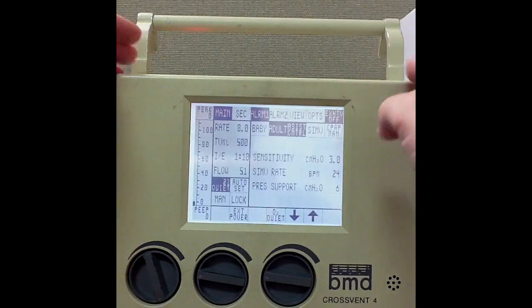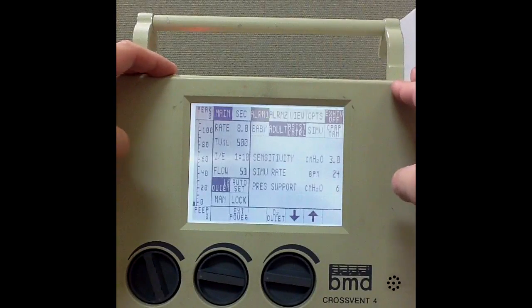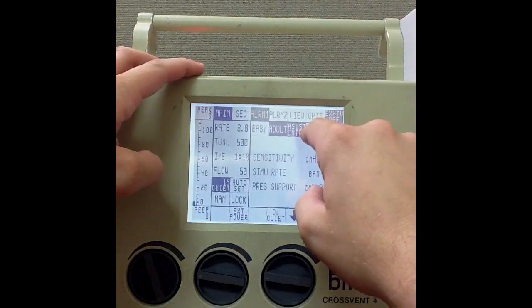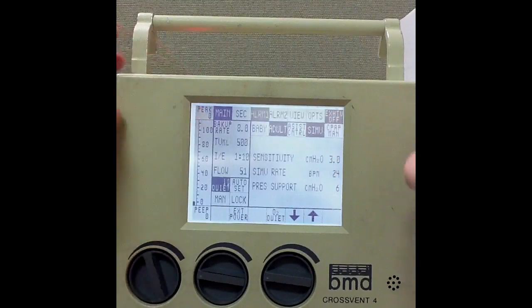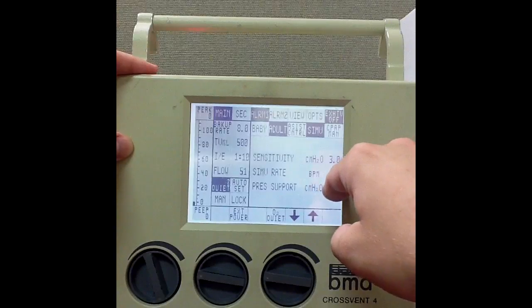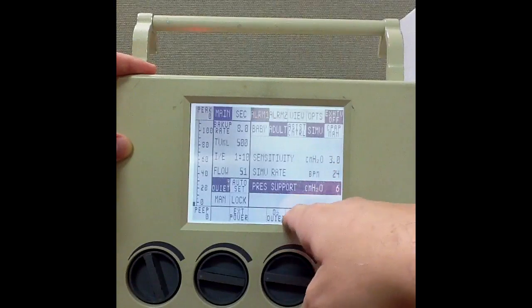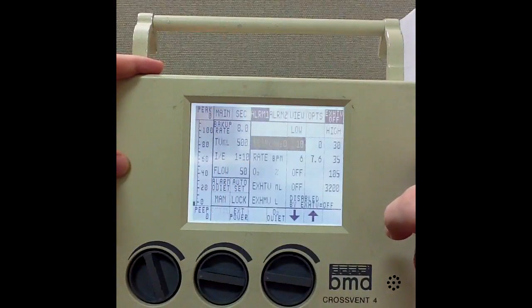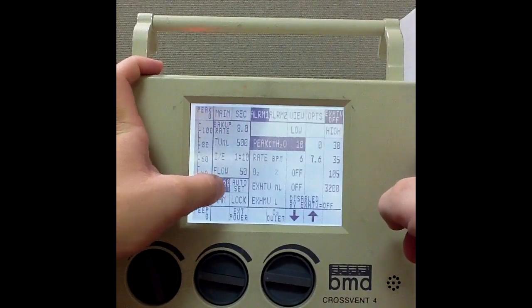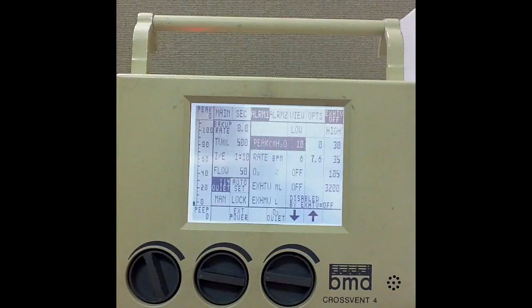Let's say that we want to change things a little bit. I want to go from assist control into SIMV — I'll simply select SIMV. My backup rate remains the same. But now that I am in SIMV, I can change my pressure support. Let's say that we want 5 of pressure support — I'll go down and select 5 — and then we can go back to main.